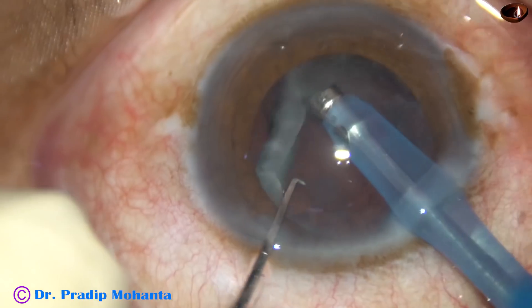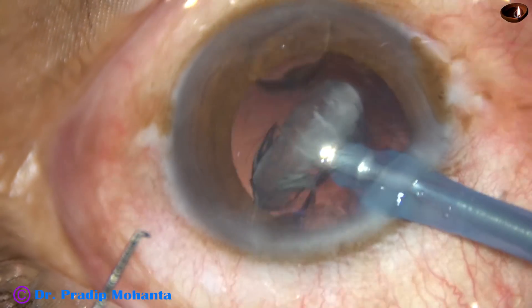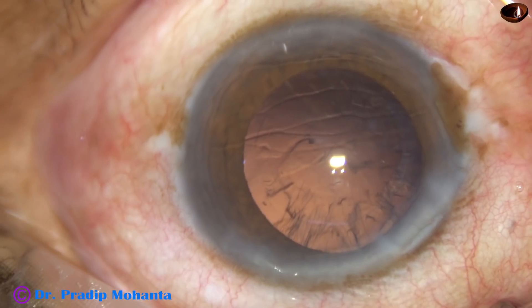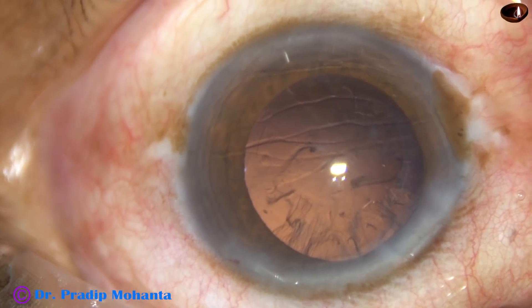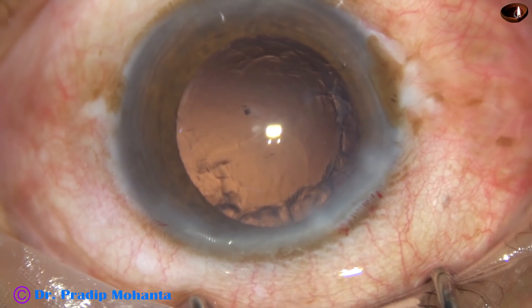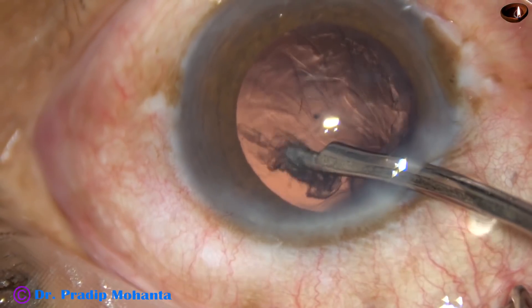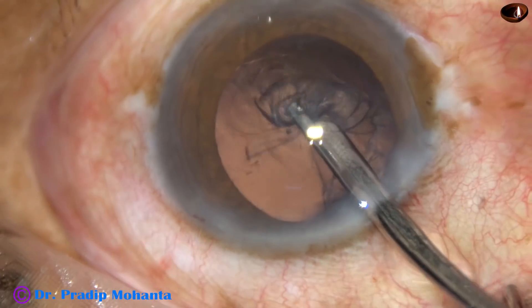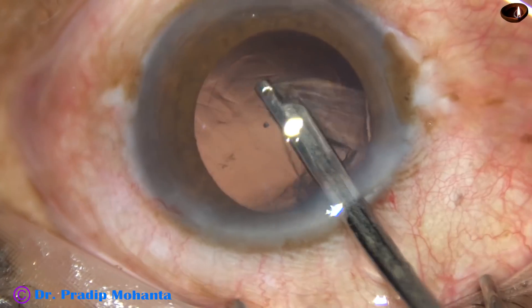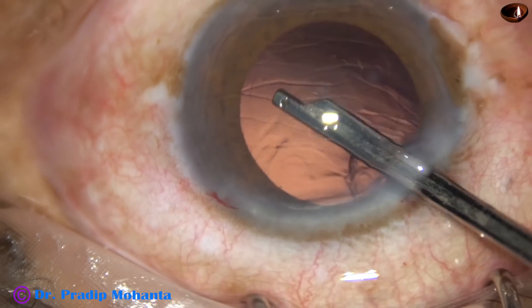Now see the epinucleus — the chopper has been used to flip the epinucleus shell and it has come out in no time. Nucleus management in soft cataracts can be done in many ways; this is one way. Just use very minimal ultrasonic energy and vacuum, go up to midway and then be in irrigation, support the nuclear mass with the faco tip, and use the chopper to slice the nucleus into several parts. Then using very minimal ultrasonic energy and low vacuum, we can emulsify the nuclear pieces.